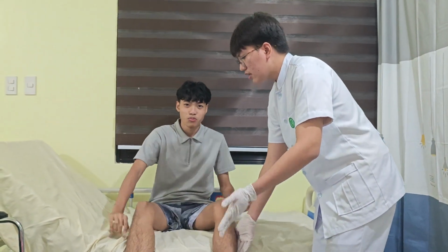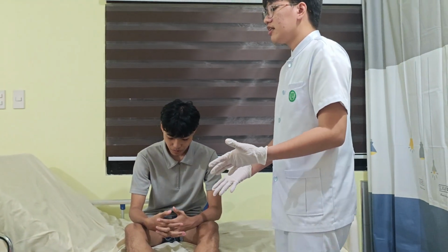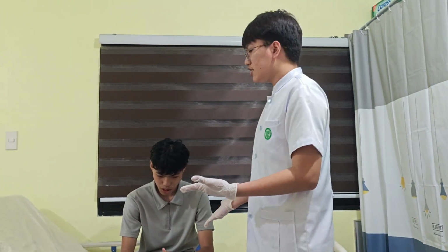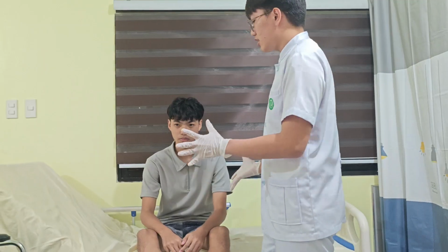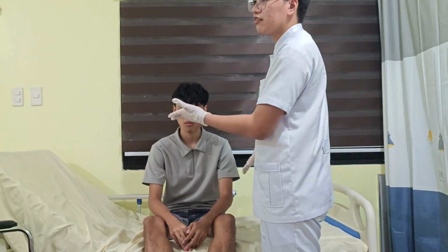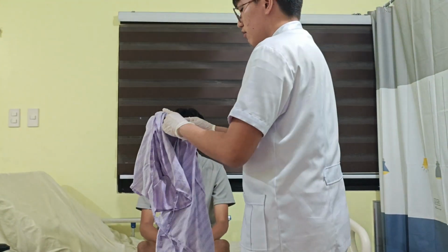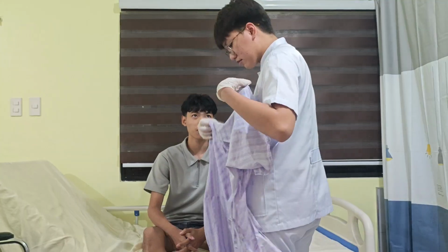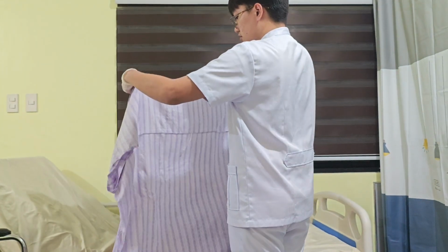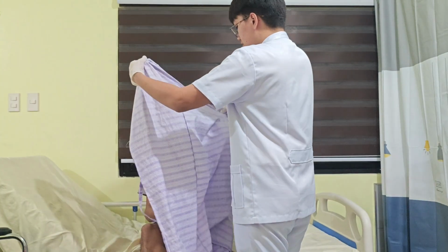Okay. After doing that, I'm going to stand in front of the patient and check for any imbalance. Okay. Since the patient is balanced, there is no risk of falling. So to provide the room for warmth, as well as privacy.